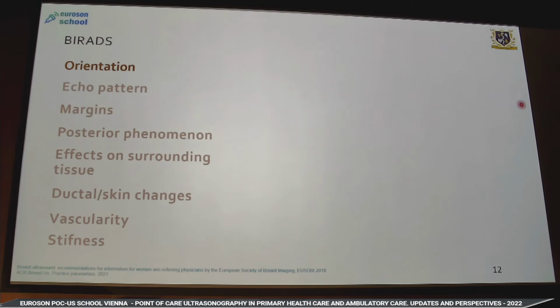What about BI-RADS, without really getting into the depth of BI-RADS? Actually, from the point-of-care ultrasound point of view, it's important to know if it's high risk or low risk, if it's solid or liquid. I think these are the main things that we should take into consideration.